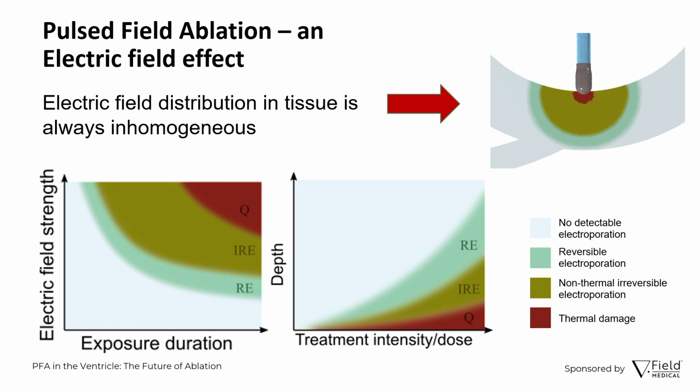So if we go far away from the catheter, nothing's going to happen. If we are very close to the catheter, we're going to see thermal damage. And in between, we're going to see cells trying to decide, am I going to survive or am I going to die? And eventually, that's what we are faced with.